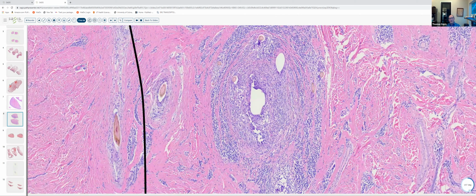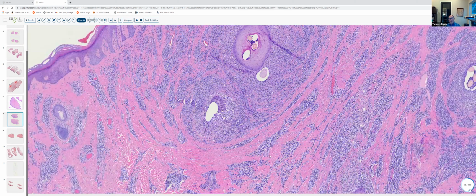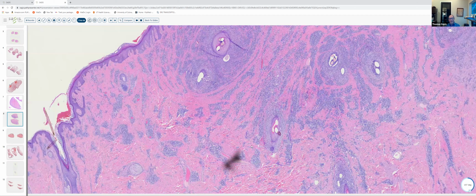And here you can see we've got actually a little focus of suppurative folliculitis, which is ruptured. And so what we've got here is acne keloidalis nuchae, which is basically, in most instances, a hypertrophic scar. As Elston points out in this text, the keloid is in the name. And here you can see the neutrophils. So we've got this suppurative folliculitis that's rupturing and is periodically active, kind of waxing and waning.